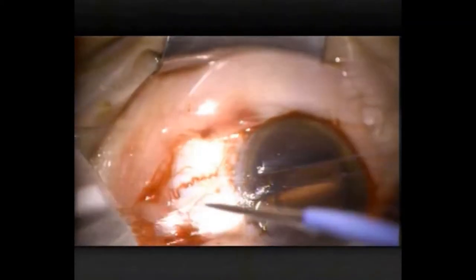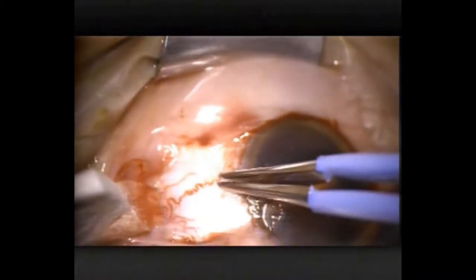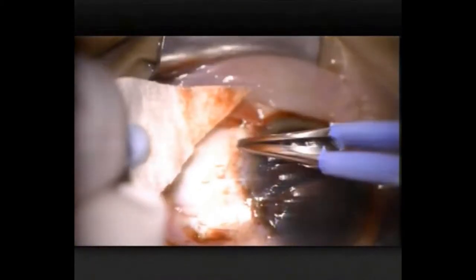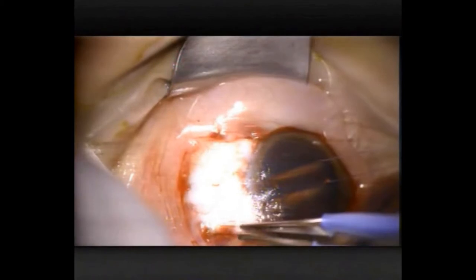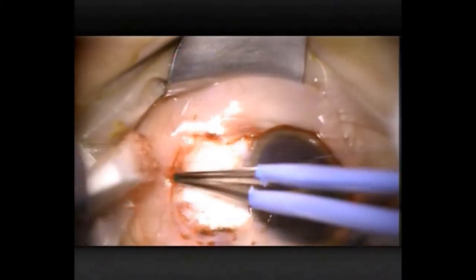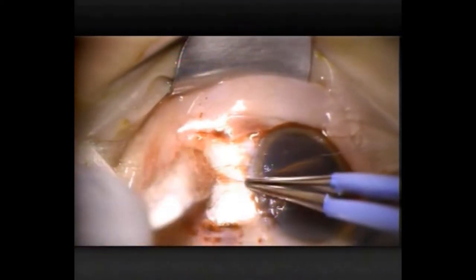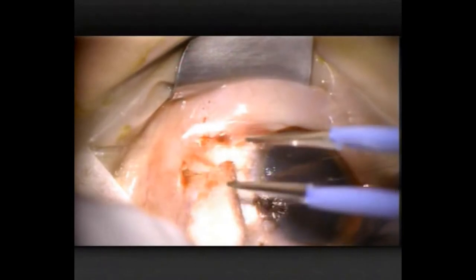Now for a bit of cautery. I like to have minimal hyperemia post-operatively, so all these slightly dilated vessels I'll cauterise. Obviously blood gets in the way if you're trying to see what you're doing during the surgery as well. Now I'm teasing out the vessels from that horizontal meridian and cauterising them too.